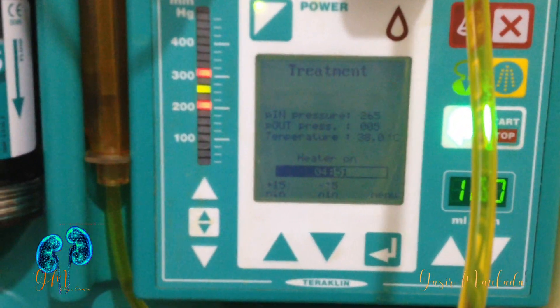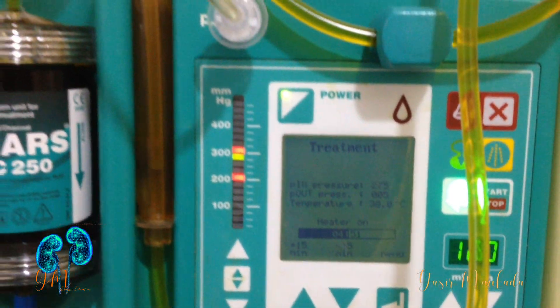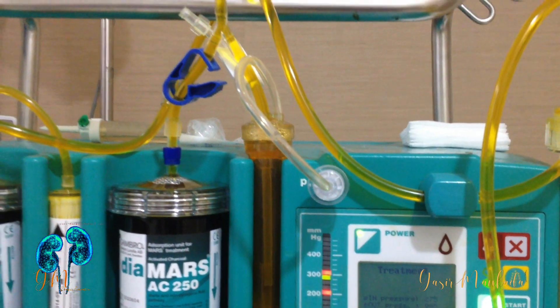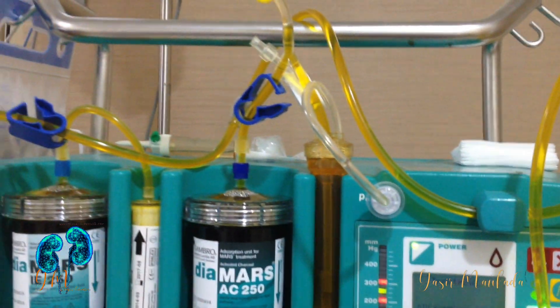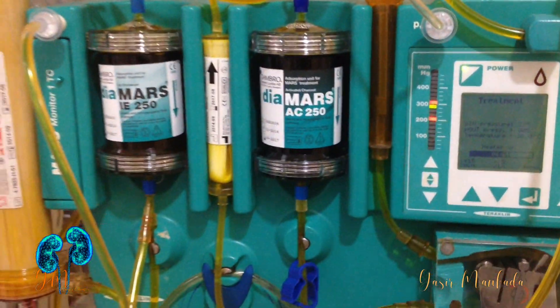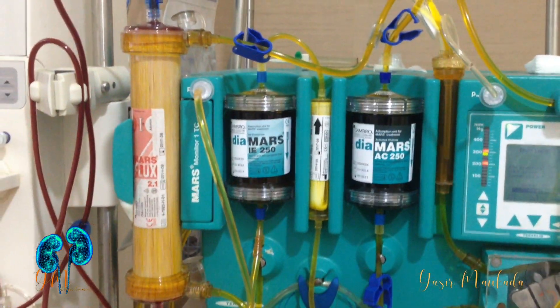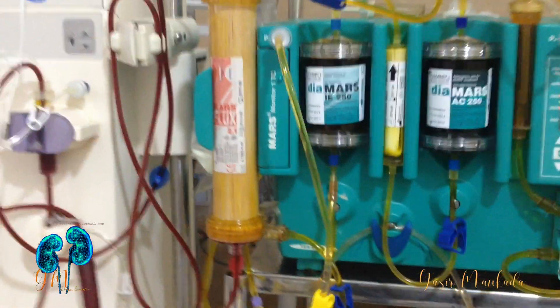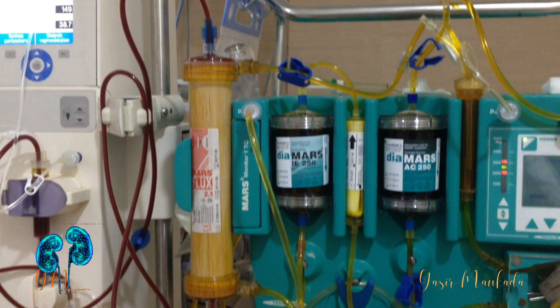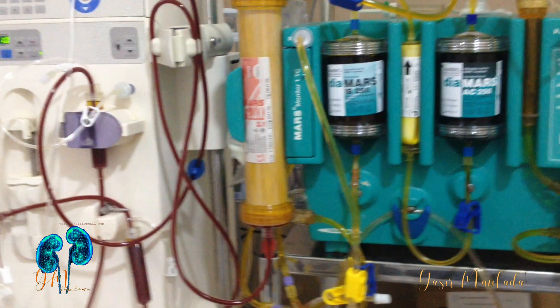This membrane is capable of adsorbing albumin-bound toxins. The albumin circuit generally contains about 600 milliliters of 20% human albumin and is also driven by a pump at a speed of around 150 milliliters per minute. This is passed through the dialysate compartment of the blood dialyser, where it removes the toxins bound to the dialyser membrane.